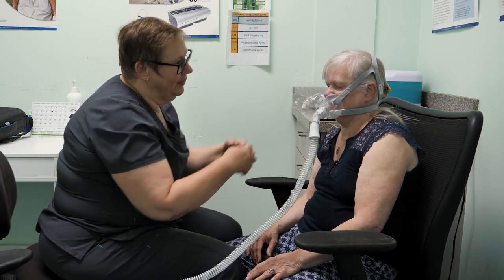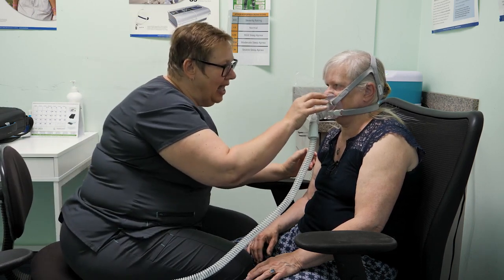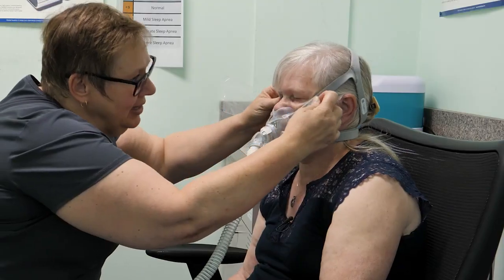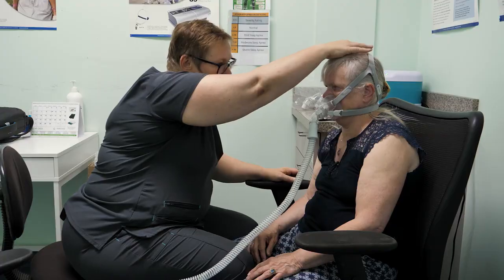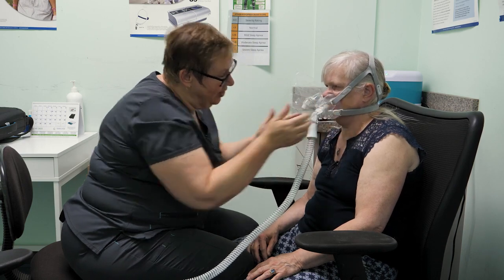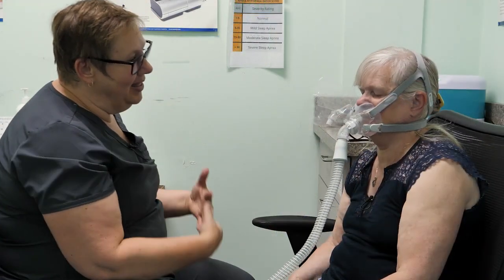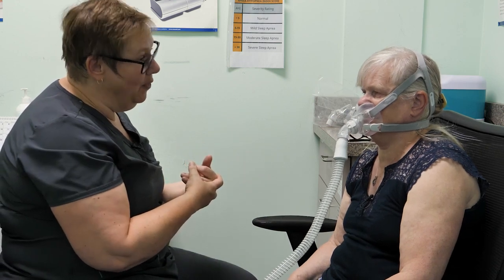Yeah? Okay, so with this mask, if you find that you get a leak up here, which is normally where we find one, then you can just tighten these ones just a little bit like this until the leak is gone, or you can tighten it up here on the top. If you find that it's leaking down here, then you're going to tighten these straps a little bit. Okay? So would you like to try some of the other masks at this point in time so that you can see how they feel and you can compare one to another?